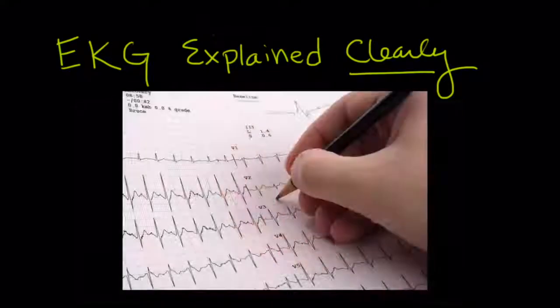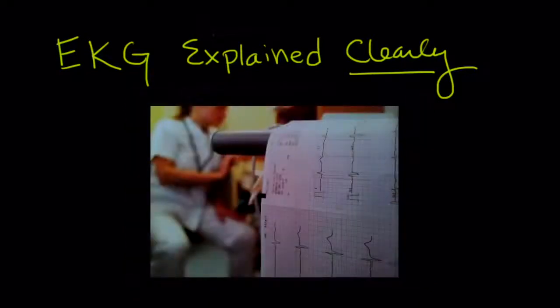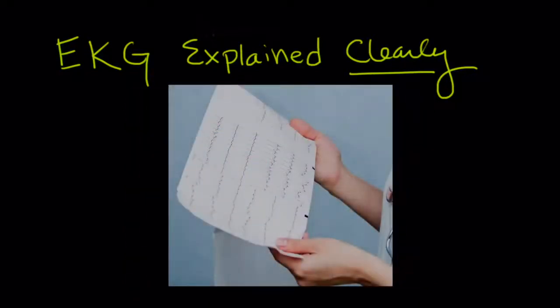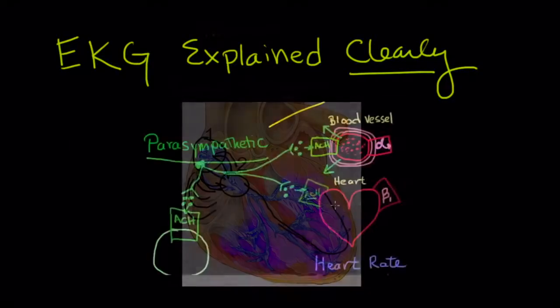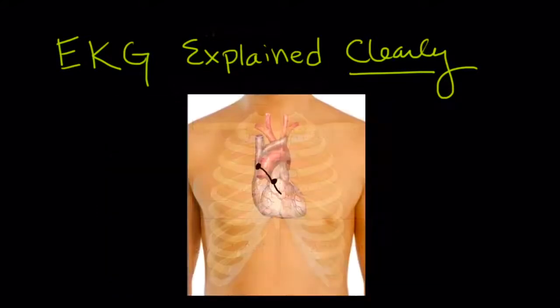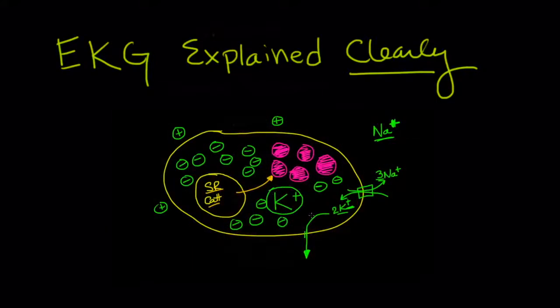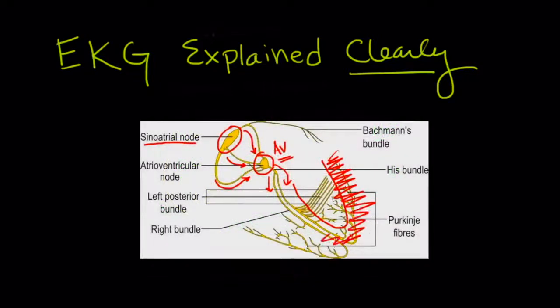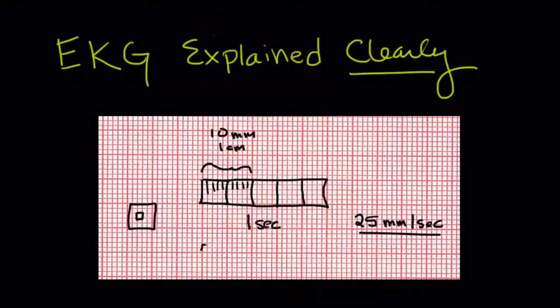Whether or not you have experience with EKG interpretation, I think you'll find this series of videos very useful. If you understand the key foundations of how the heart works, it'll be much easier to learn and remember the nuances involved with the EKG that we'll cover later in this course. So we'll start with the anatomy and physiology of the heart, depolarization, repolarization, and then on to leads and specifics about EKG paper and how a tracing is captured.